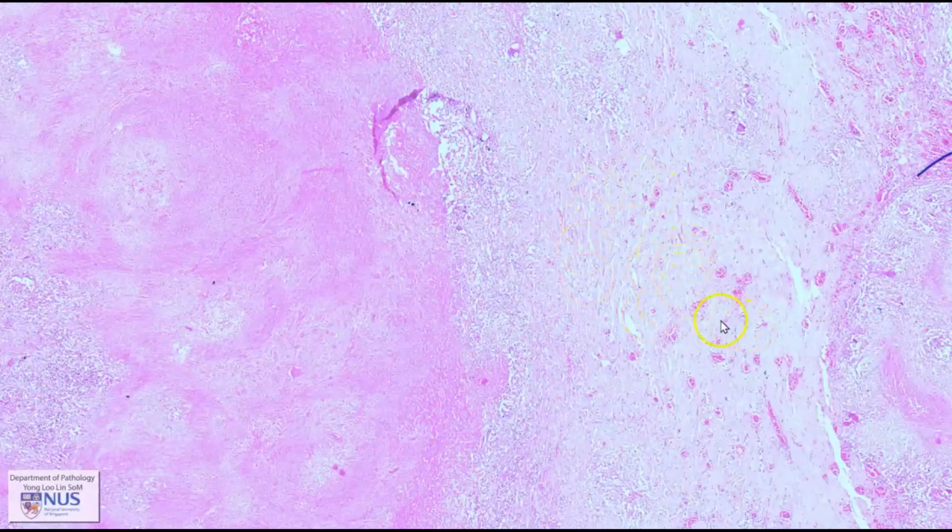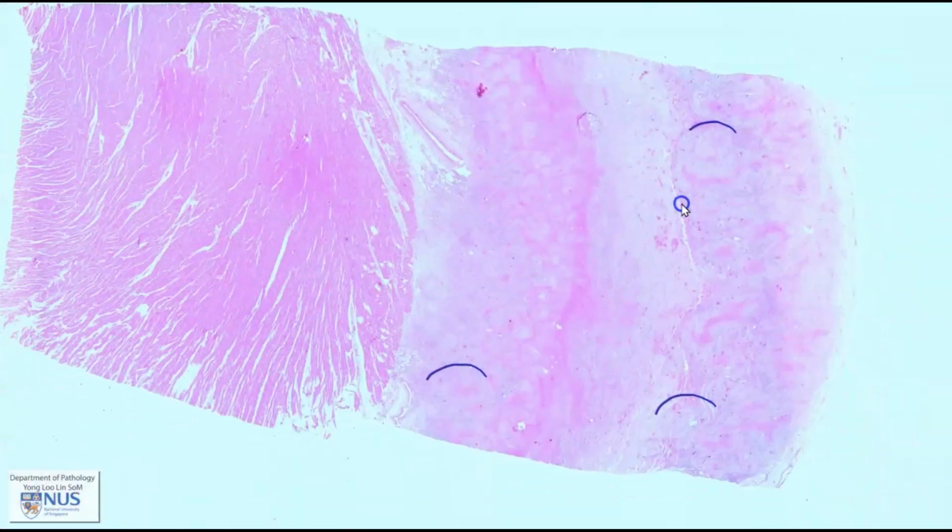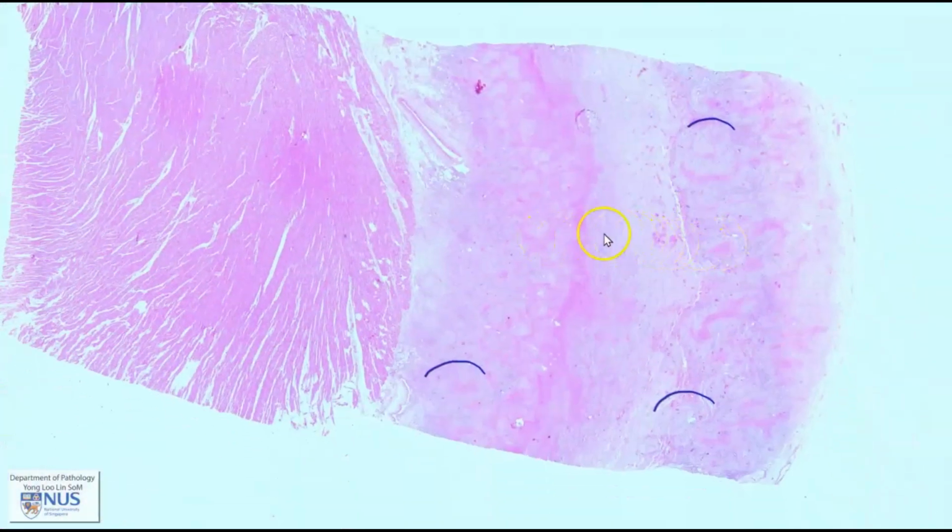And this shows evidence of organization. So in the more acute phases of TB, there is a lot of fibrinous exudate, and over time, this organizes into fibrous tissue. And this is how the pericardial space becomes obliterated because of this inflammation and organization. And this will eventually lead to constrictive pericarditis and potentially heart failure. Let's learn a bit more about tuberculous pericarditis.